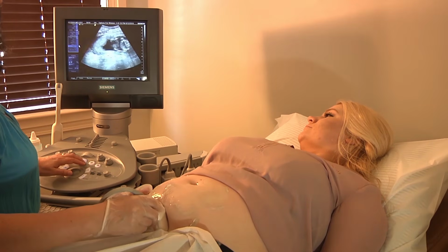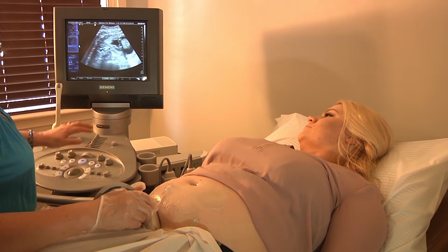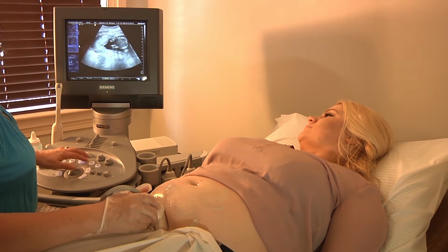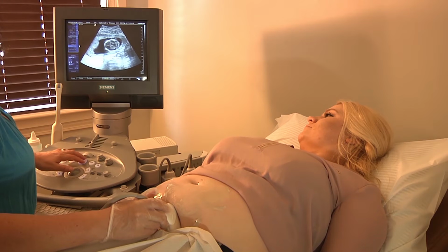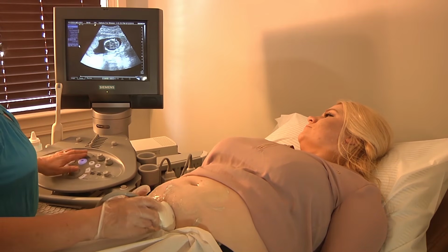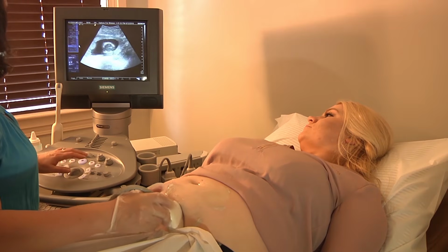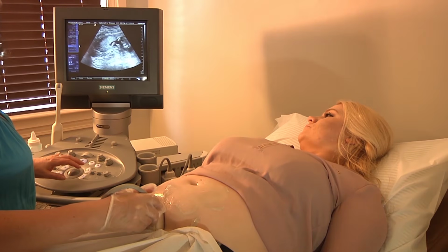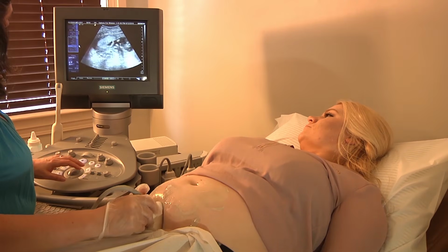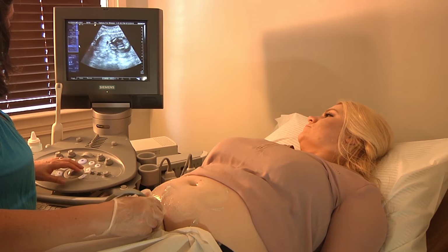The next one's here. Okay, go down to the heart. Oh, you got the heart. Now go down and get a femur. Okay, go get that femur bone. I just had it. Oh, see, look, did you see that? You got an eye though. You still got a little bit of that eye. No, I thought I had that. Okay, so I'm up here. Oh, we've got to look for the sex. Forgot about that. Okay, now turn on that femur.